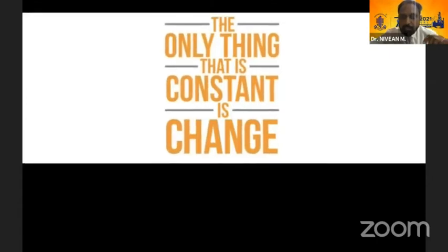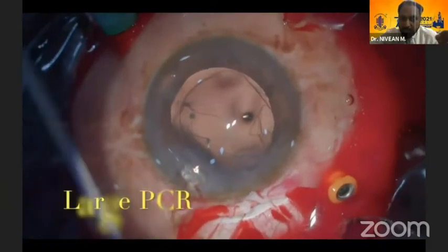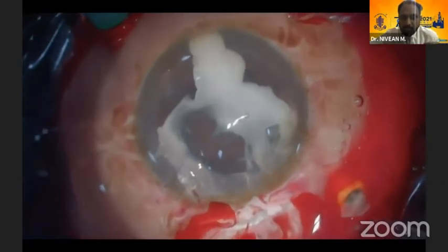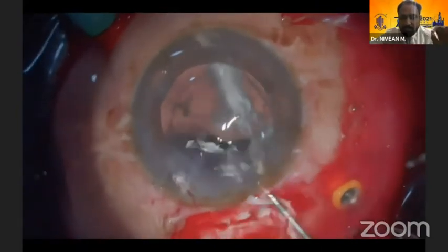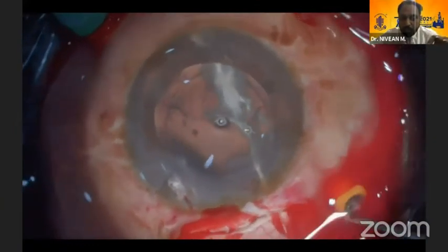But slowly times are changing, and they're talking about the pars plana approach. We can use the pars plana approach in managing larger rents as well. As you can see, this small incision case had a large rupture. Again, I'm using triamcinolone and washing it away so that only the vitreous strands get stained, so that you know exactly how much vitreous to cut. Otherwise, we won't know how much we're cutting. So we can introduce these trocars.